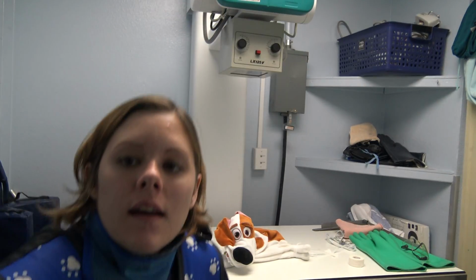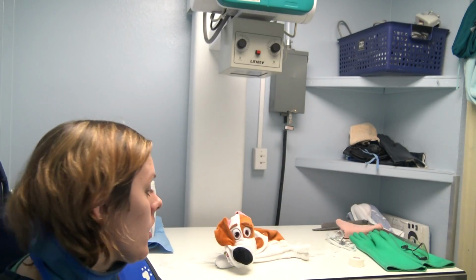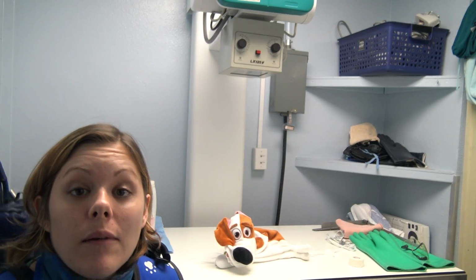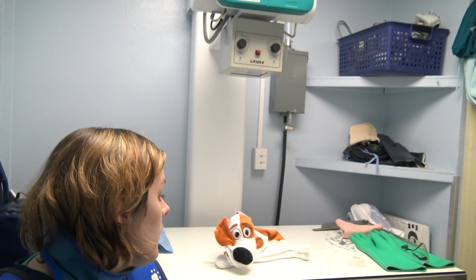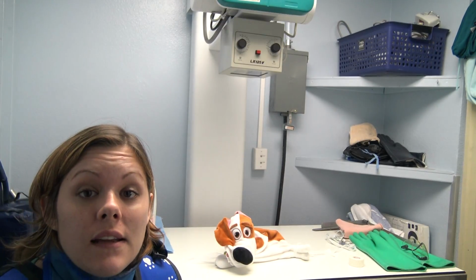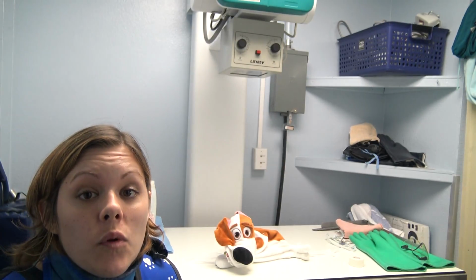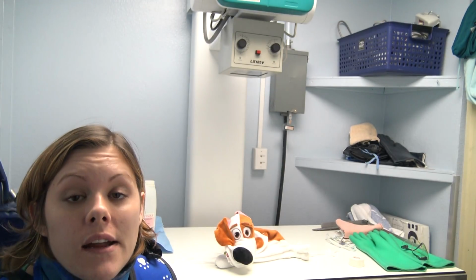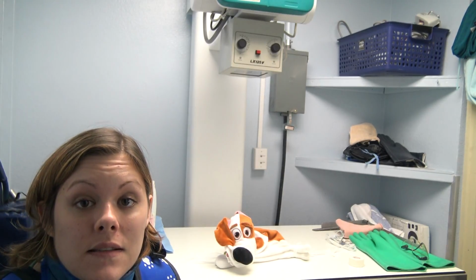Hi, my name is Samantha, and I'm going to be demonstrating a barium study on our patient here for my capstone project on Diagnostic Imaging 3. For barium studies, typically the indications would be vomiting, diarrhea, foreign bodies, and abdominal masses.